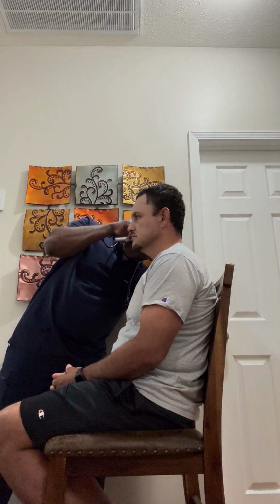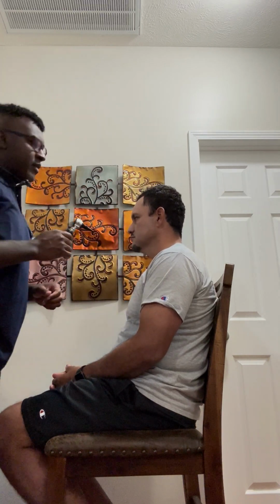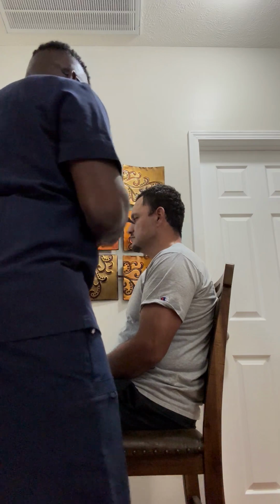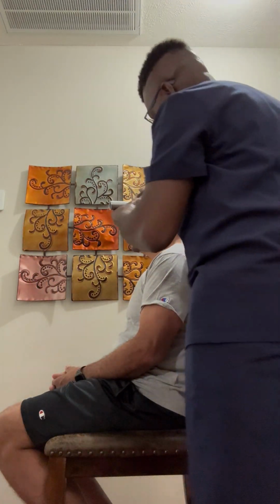I'm looking to examine the tympanic membrane and make sure there's no redness or bulging or drainage present upon looking in the ear, and none is present. I'm going to go over here, the same thing. Looking into the left ear, I'm going to support it with my left hand, and I'm going to continue to insert it and support it against his face until I discover the tympanic membrane. I'm examining for any drainage, any redness or bulging in the ear, and none is present.